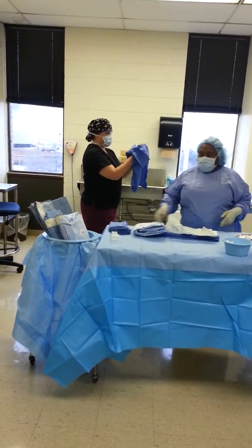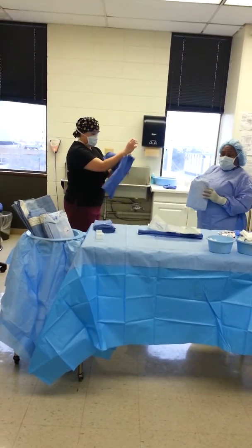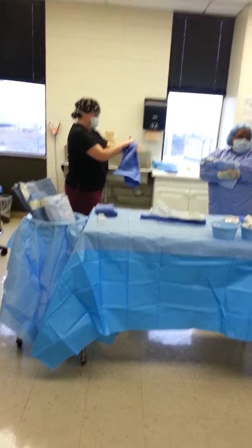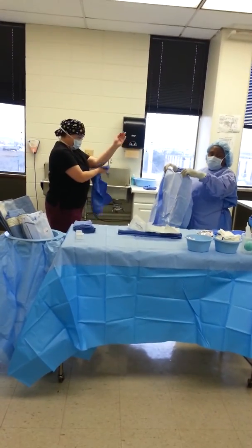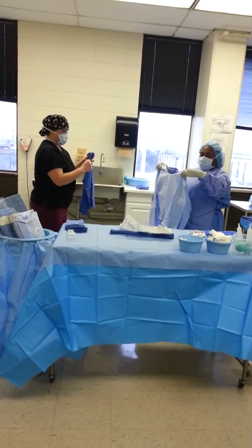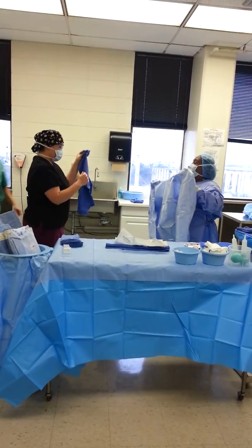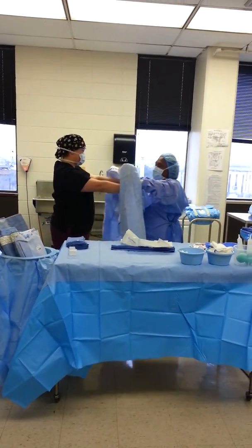Now she dries. While she's drying, I'm getting the gown so that she can put it on. I know the face doesn't face me because I'm not putting it on. So I'm unfolding, but see, I'm a distance away from her. Circulator, you need to get in position. The circulator has to tie the gown. Present it to the circulator. She immediately walks in.